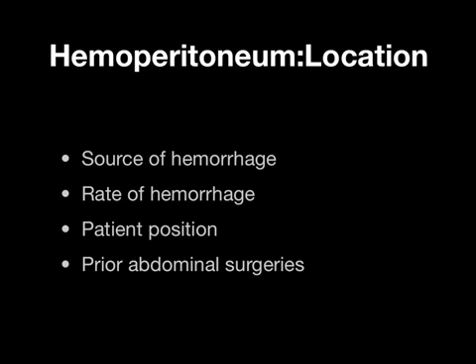Now, looking for fluid in the abdomen is going to be a little more challenging, and it's going to depend on multiple factors, including the source of hemorrhage, the rate of hemorrhage, the patient's position, and whether or not they've had prior abdominal surgeries and potentially intraperitoneal adhesions.